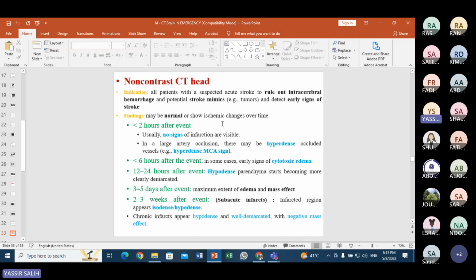كده انتم تكونوا عارفينها لأنها بتفيدنا في حالة الستروك early stroke. يعني السي تي حتكون نورمال والبيشنت عنده symptoms raising the possibility of infarction or ischemia, brain ischemia. Try to go and read about it، اللي هو تعرفوا ايش اللي هي which methods help us in early detection of infarction. أهم شيء انه زي CT.